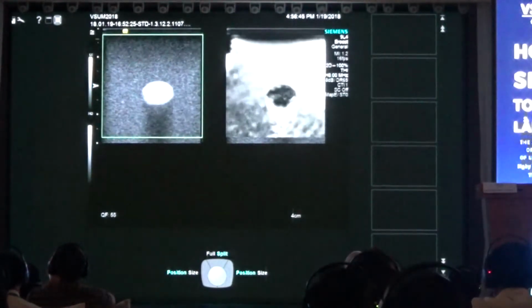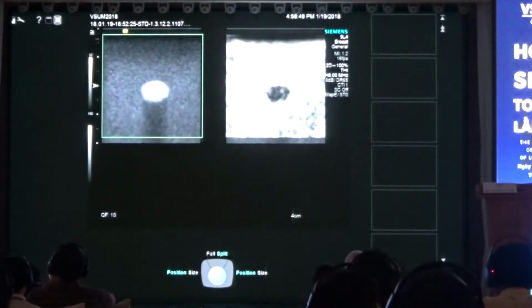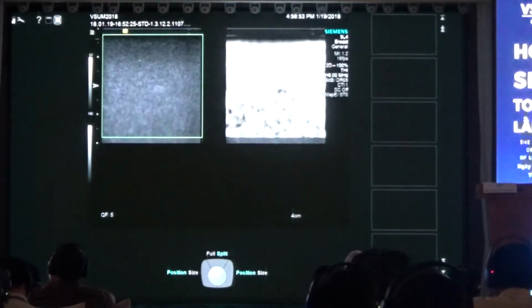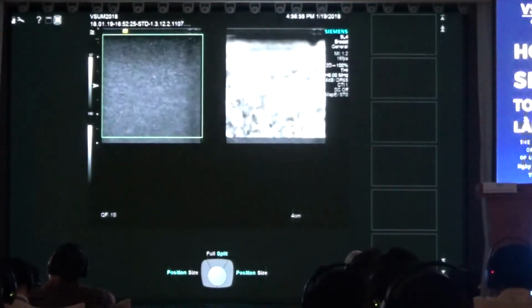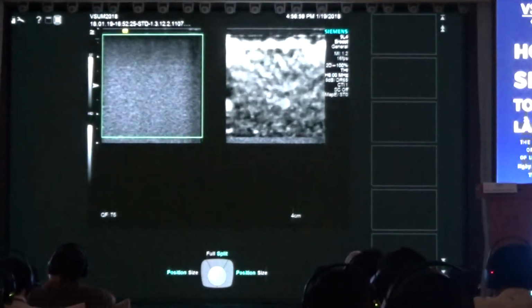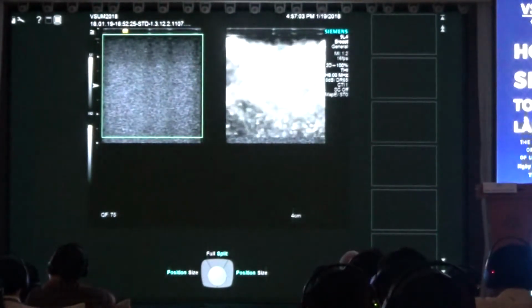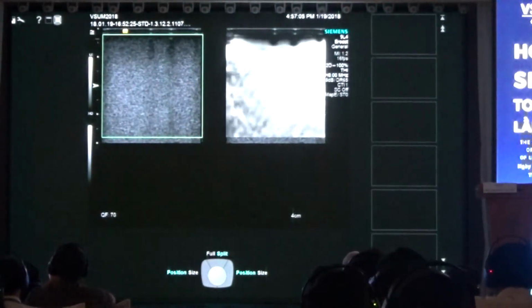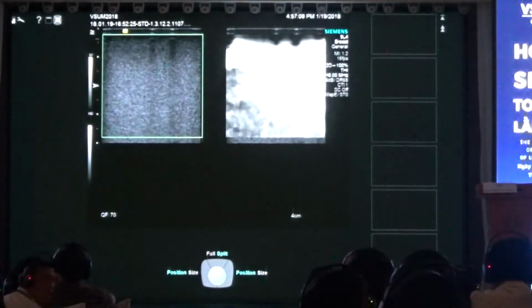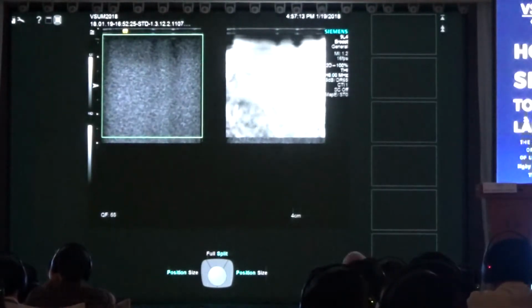Now, one of the things you should look at when you see this pattern, where you tend to have what I call the worm pattern, it looks like things are changing and it looks like worms moving all over, that's all noise. And you'll often see that when, as here, I've now only got the background tissue. There's only one tissue type. Everything is the same stiffness. So the machine doesn't know what to do because there's no difference. So you often get this noise pattern.